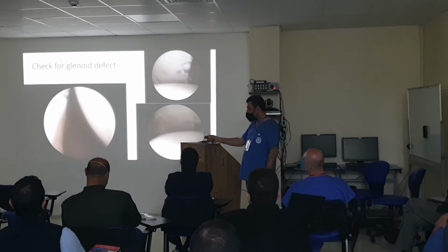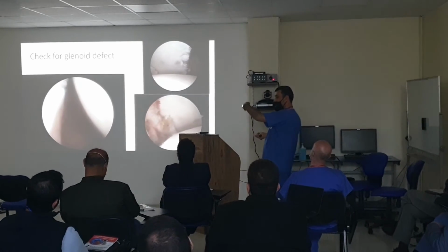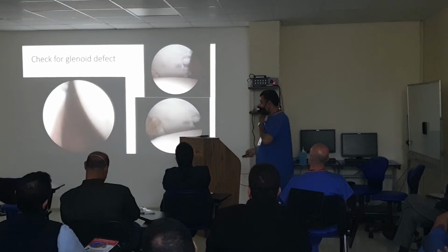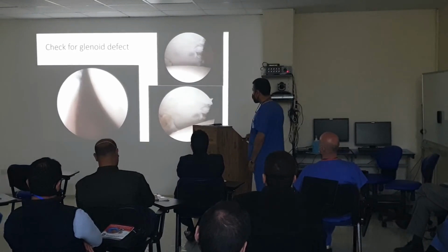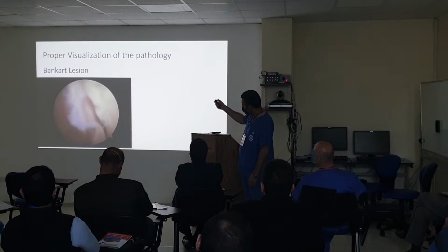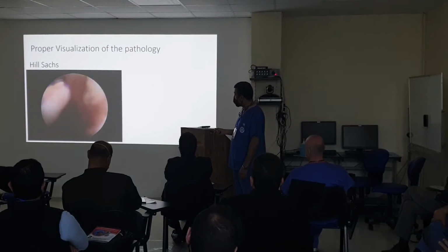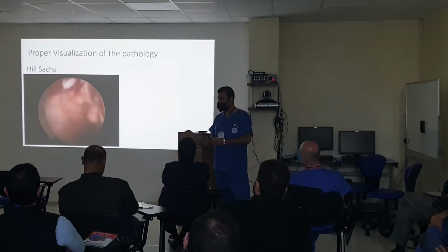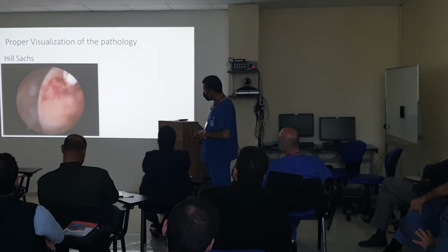Looks large, yeah? But look here, how large is the defect? When you go to the anterior superior portal, you see how huge is the glenoid defect. So you have to see the pathology, not only by image, but by proper scope. Here, large Bankart lesion. You see it descending from superior. So here, Hill-Sachs, and this is one trick. You see the Hill-Sachs is that you push the arm anteriorly when you are from behind. And you see how huge here is the Hill-Sachs lesion.